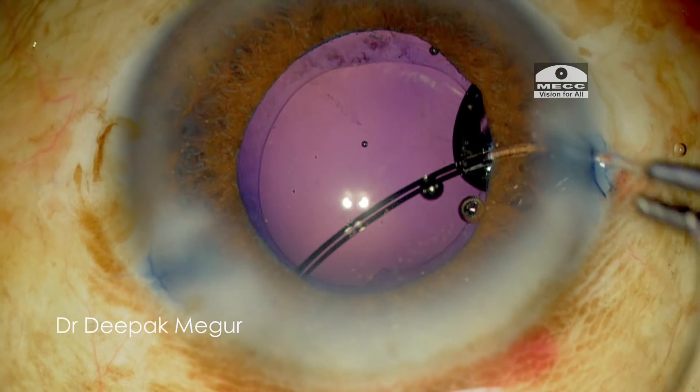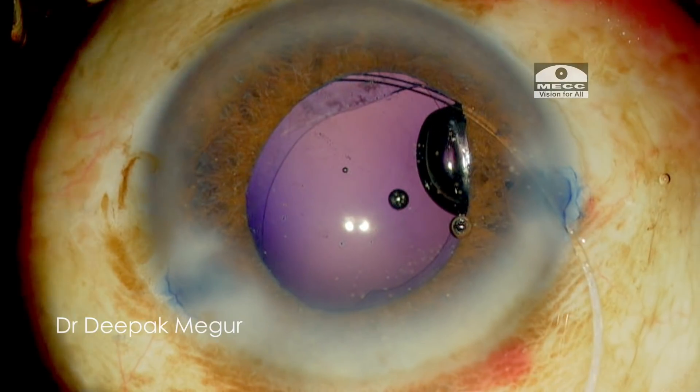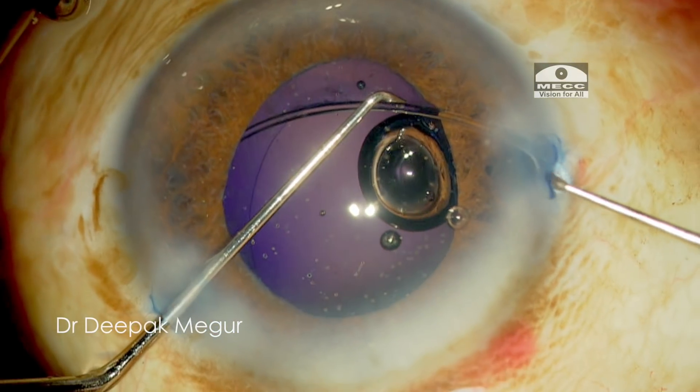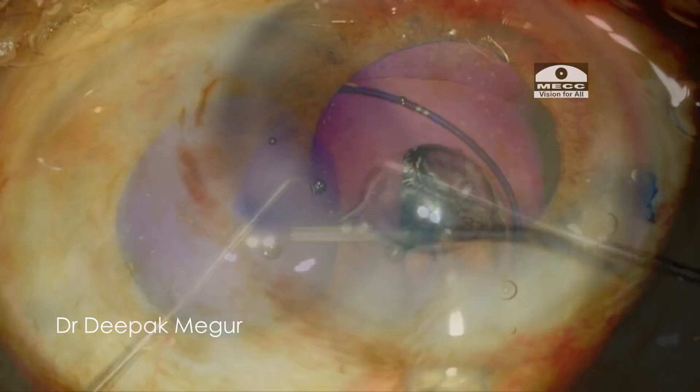After inflating the bag, I am implanting the CTR to provide equatorial support. Then a multi-piece hydrophobic IOL is placed in the capsular bag. OVD is removed and the wounds are hydrated.